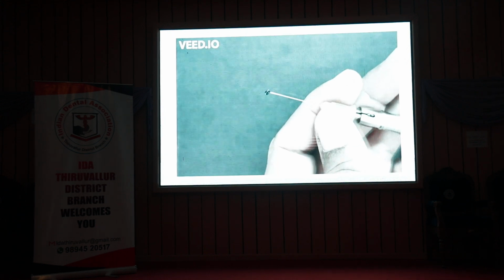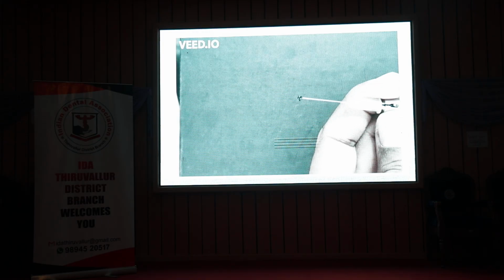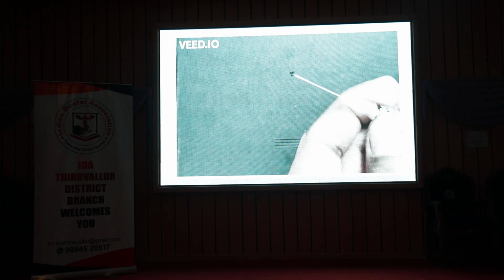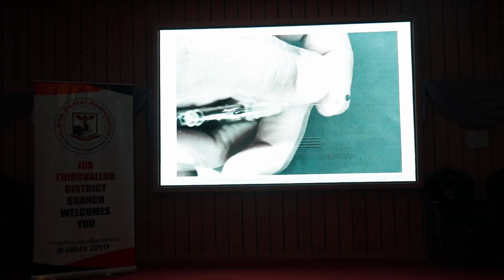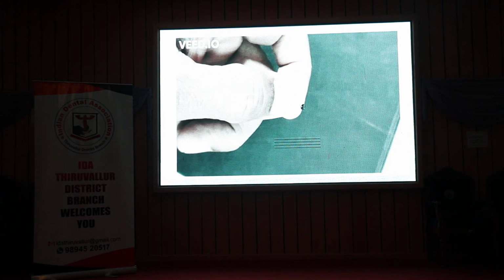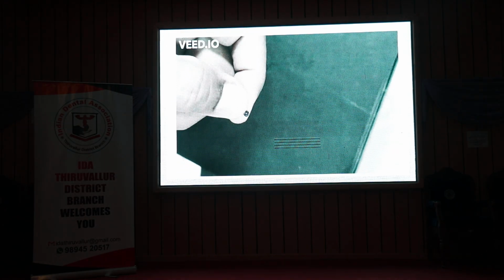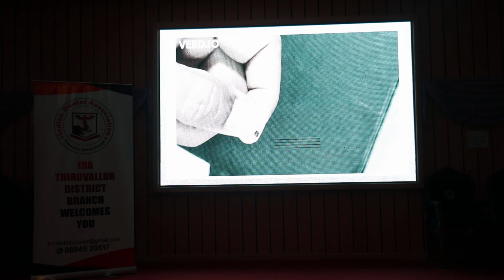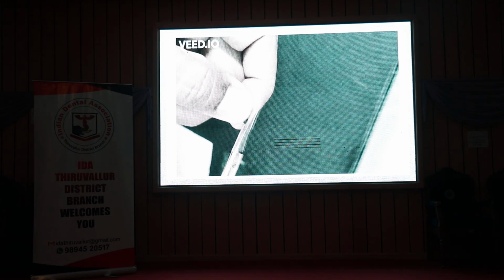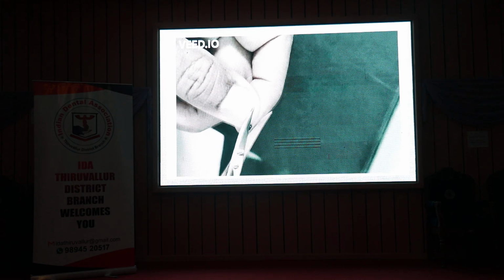I'll take a scissors, cut half of the black loop there, or the O-ring, then you will be able to see the loop. With that we will just... Most of the time the cutting is done by me.